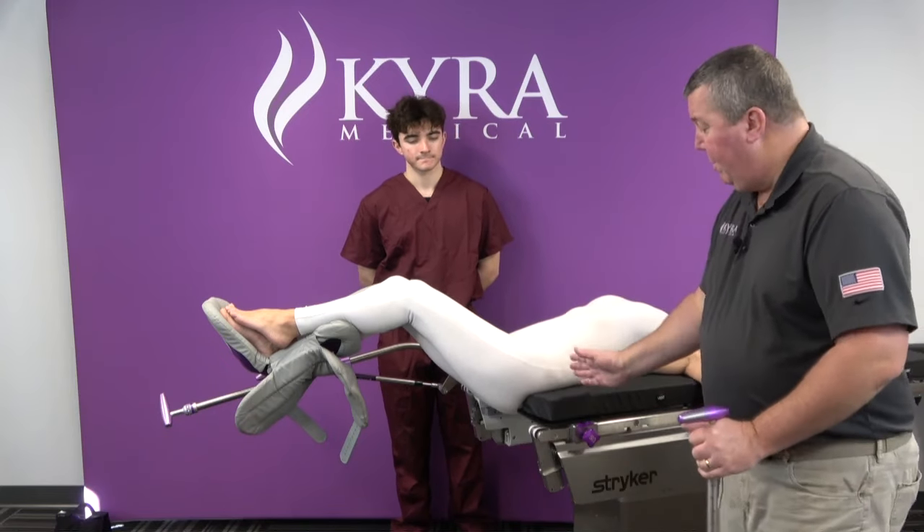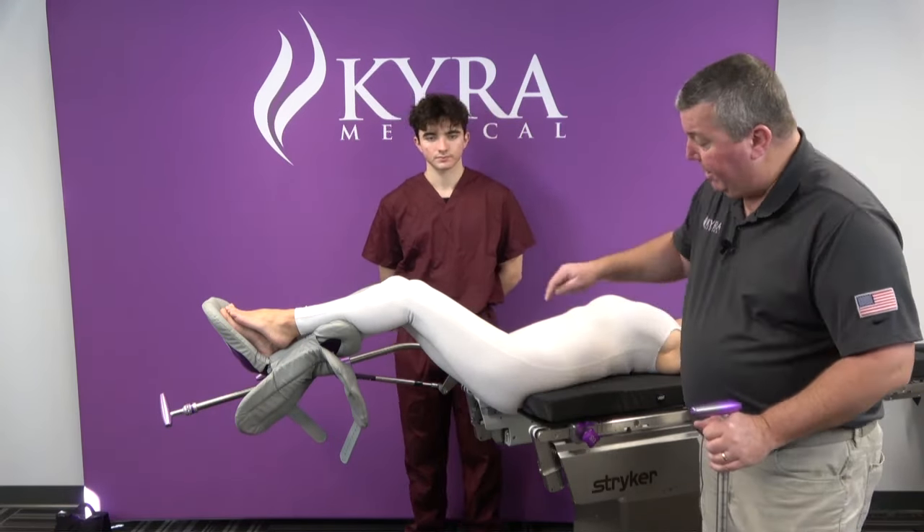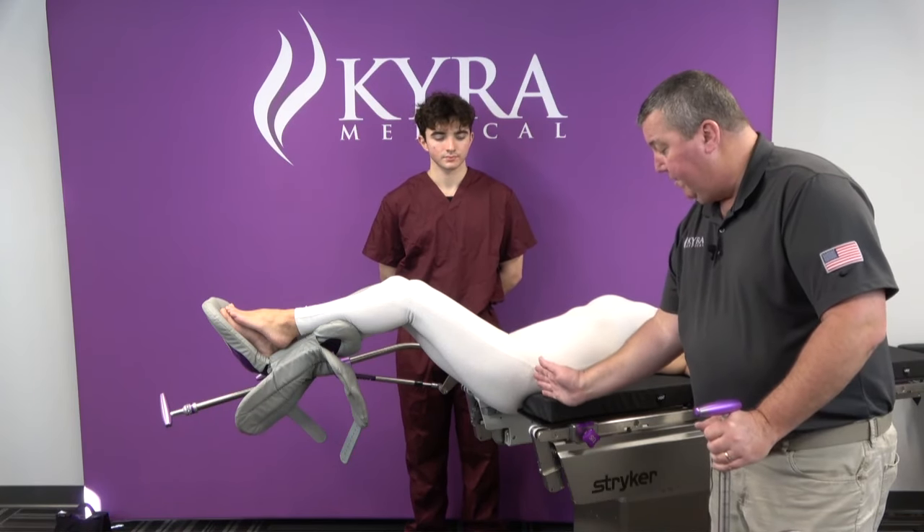We have the patient at the table. We want her scooched all the way to the lithotomy end of the table — that's typically the end of the table with the cutout. And so we've got the hip lined up.